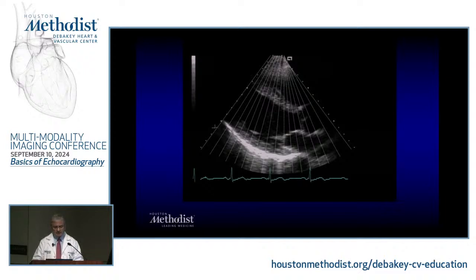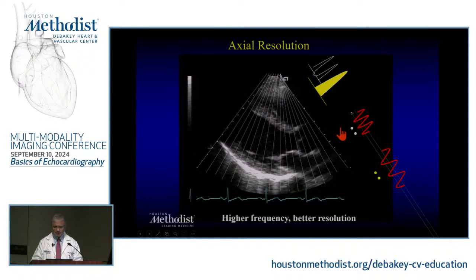Notice one thing is that since they're emanating from the transducer, as you go further and further out, there is more spread of the actual scan lines. And therefore, some of your resolution will be less the further out you are in the field, right? Your best resolution, as we talked about, is perpendicular to it. It's along the axial resolution. And we'll talk about axial and other resolution.